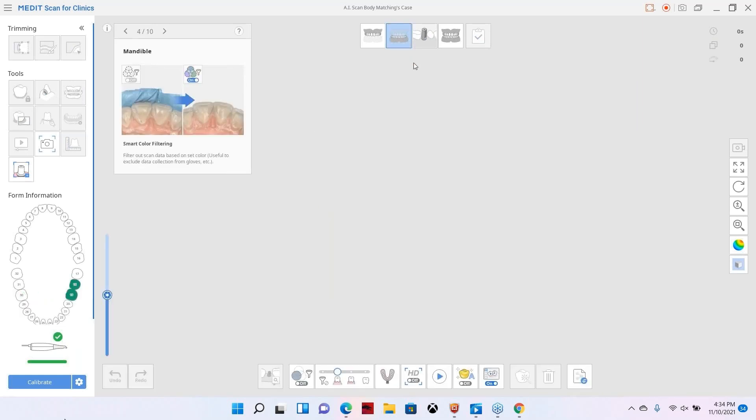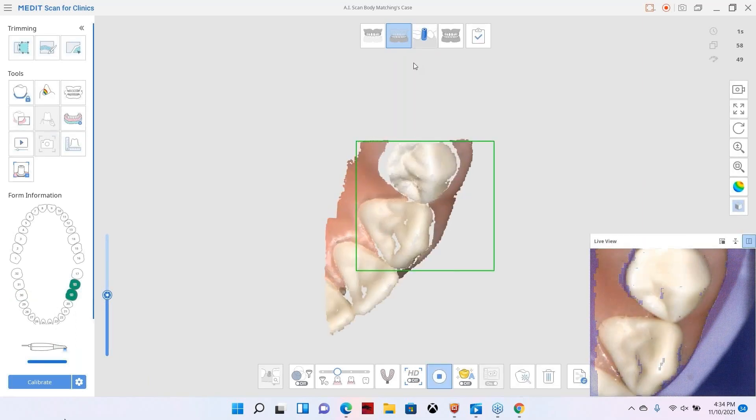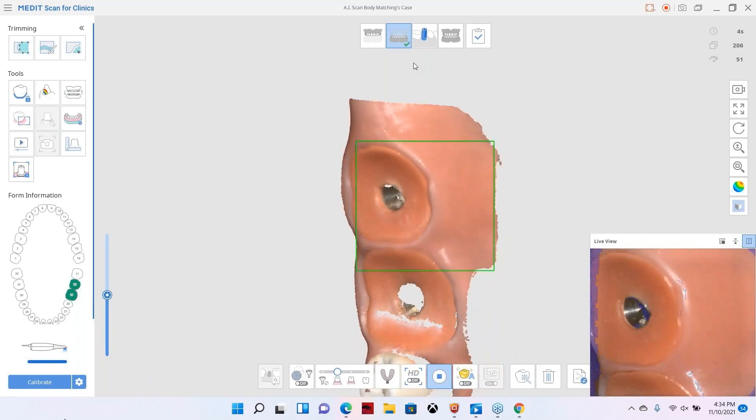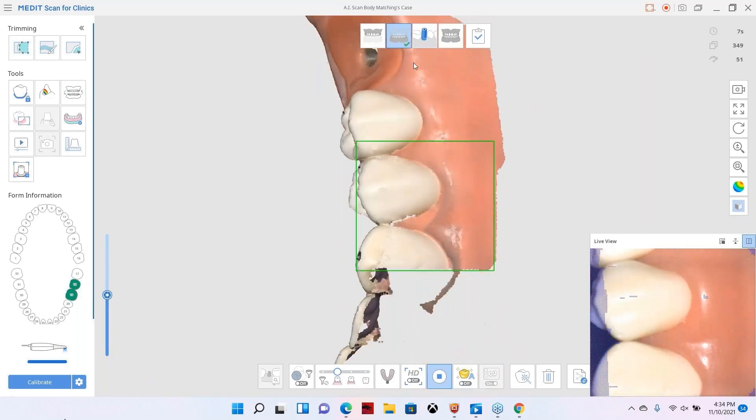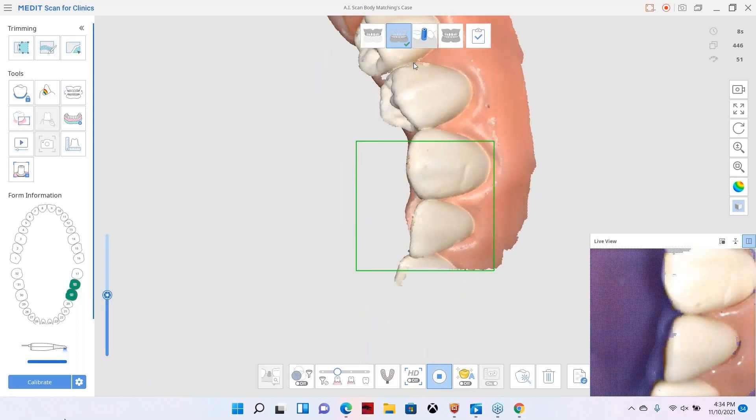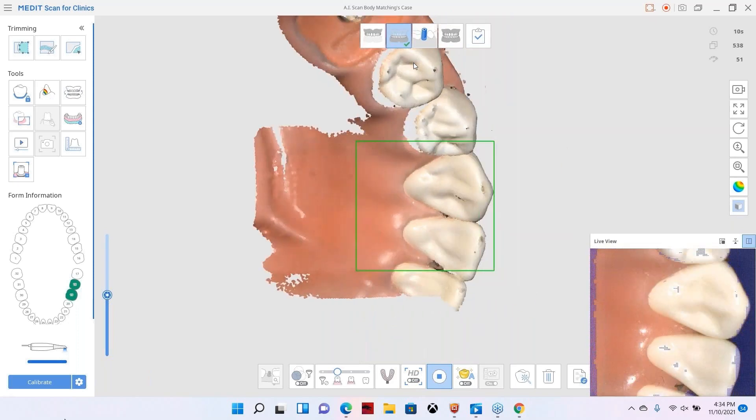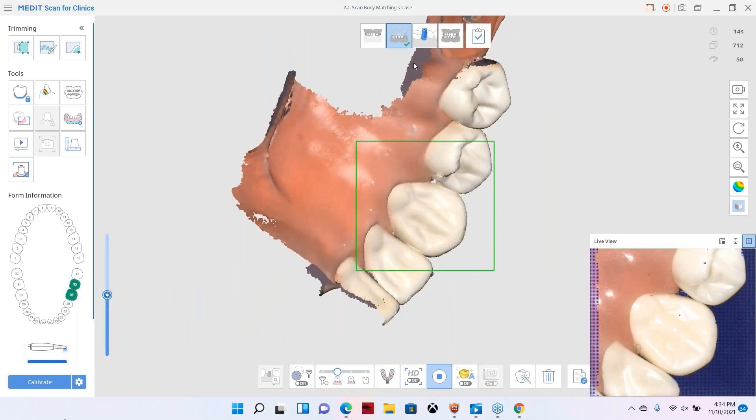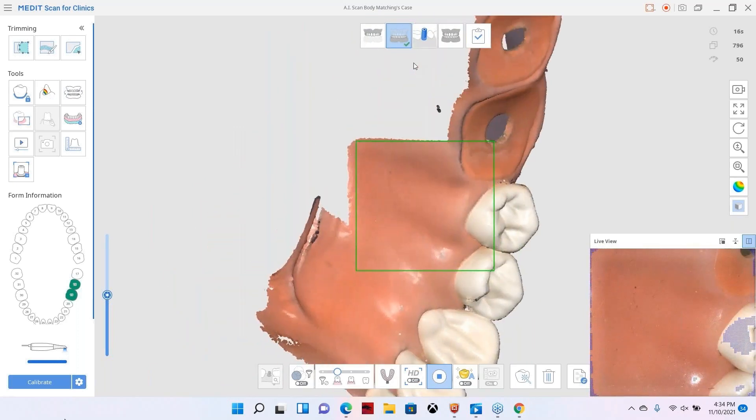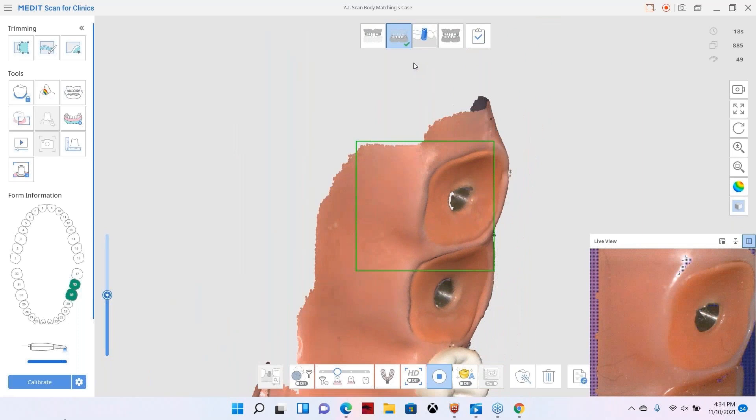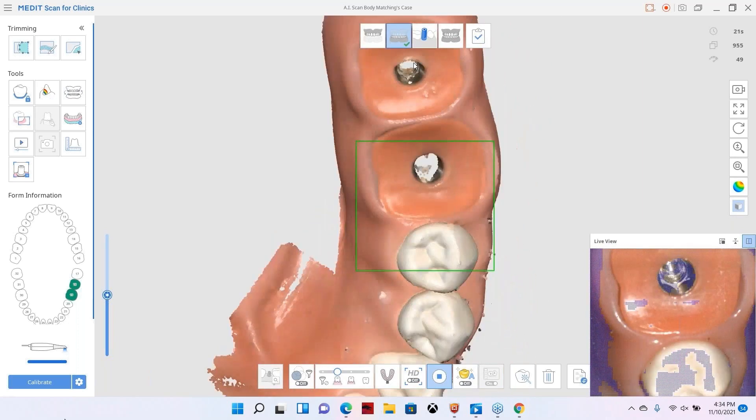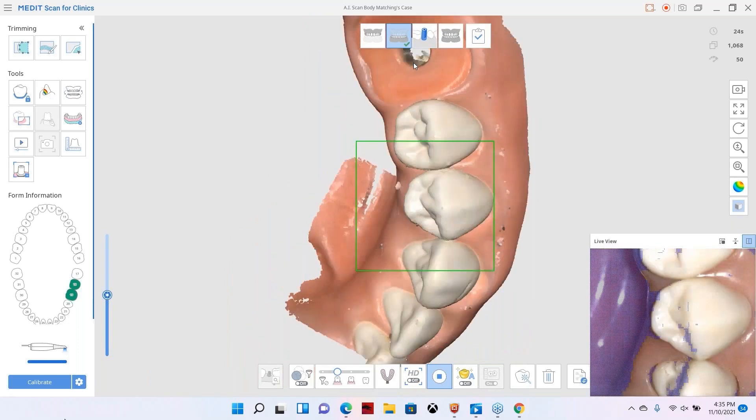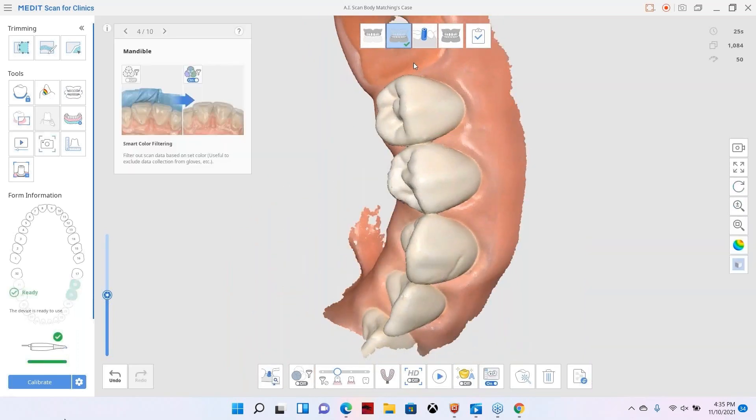Right now I'm just going to scan a quadrant mandible. We're going to do a soft tissue scan. Let's go ahead and get this quadrant. We're going to scan along the occlusal and I started forward because of the tissue in the back. Let's rock back and forth a little bit here and pick up these inner proximals. We're not too worried about getting a perfect scan here. We want to kind of demonstrate the AI scan body matching tool. So a pretty quick scan right now.